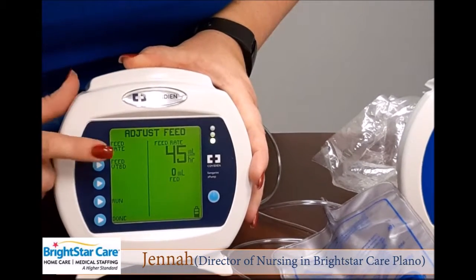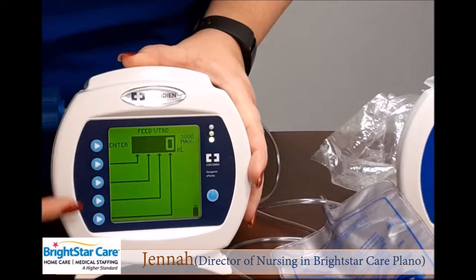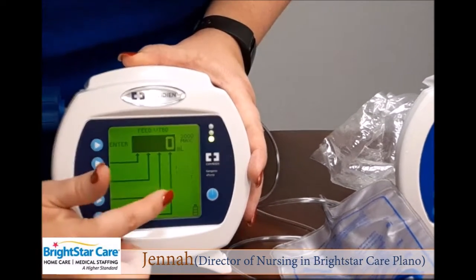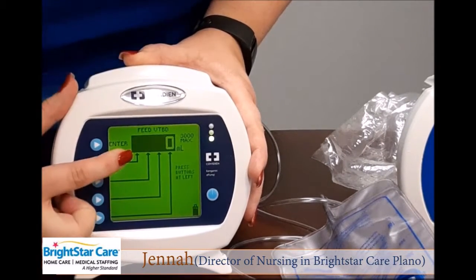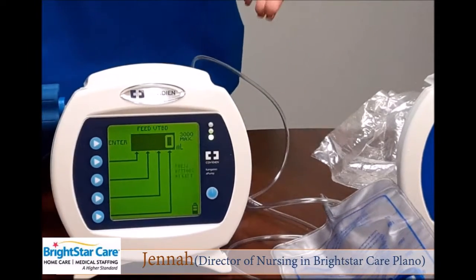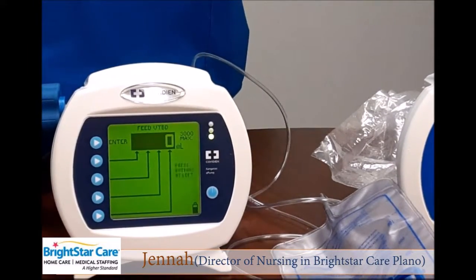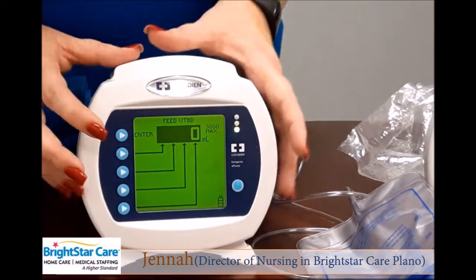I'm also going to go in and adjust my volume. Now you notice there's an extra line here. I've got my ones place, I've got my tens place, I've got my hundreds place, and now I have my thousands place. The reason you've got a thousands place on here is because your standard tube feed large bottle, especially the ones that you see in facilities, are going to come in a volume of 1,000 cc's.